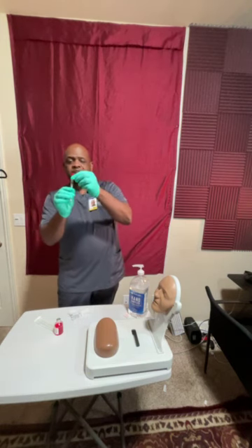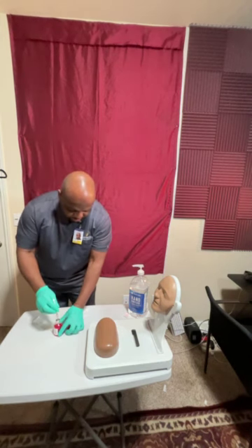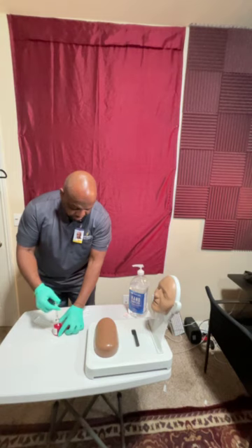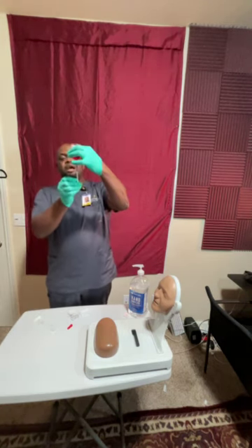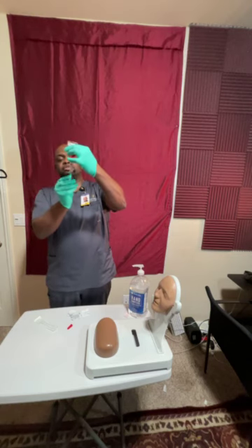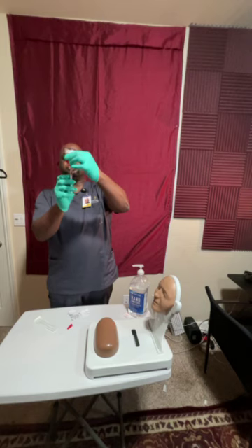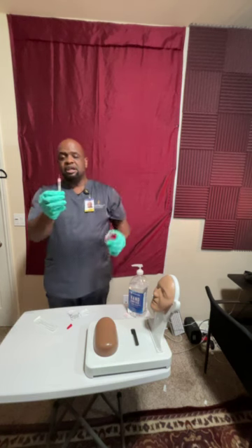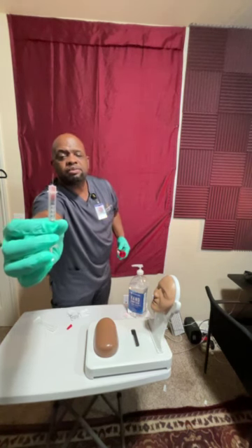With that, I'm going to remove the cap from the syringe, and I'm going to inject that air right into the tuberculin bottle, medication bottle, right? And now from there, I'm going to lift the bottle and invert it. The same amount of air that I inject into the bottle is the same amount of medication I'm going to pull out, which is 0.1 of medication. I'm going to tap it to ensure that there's no air bubbles. This time around, there's no air bubbles on this one, so I'm going to remove this. And I'm going to show the camera there. There's no air bubbles there.